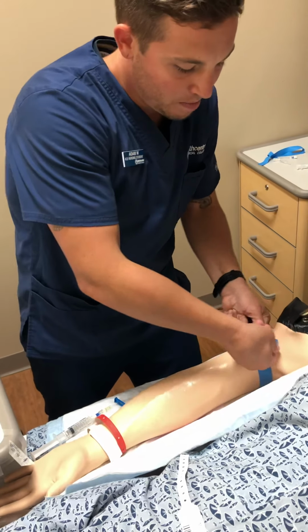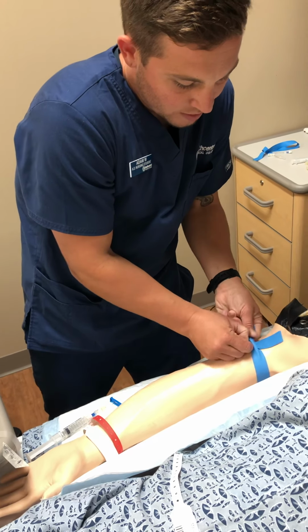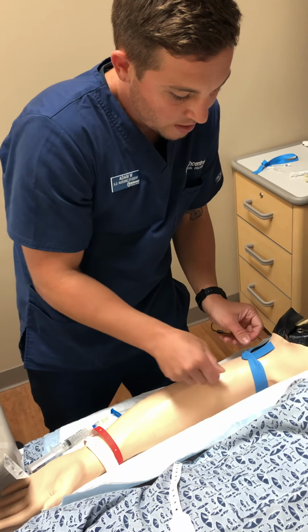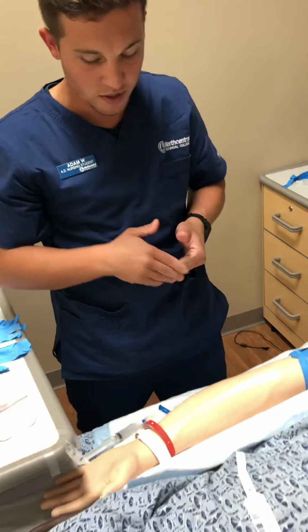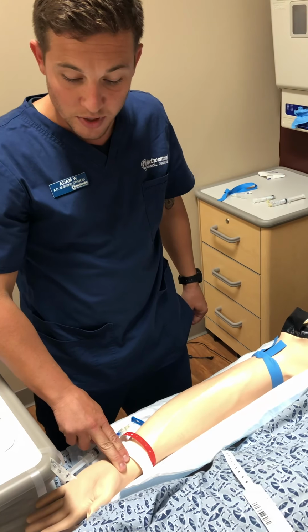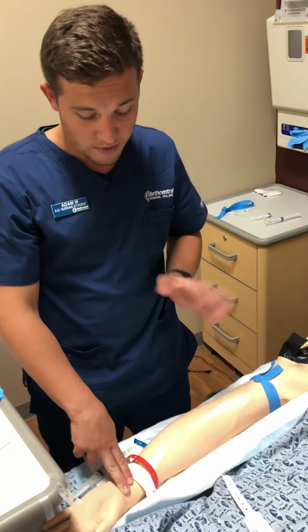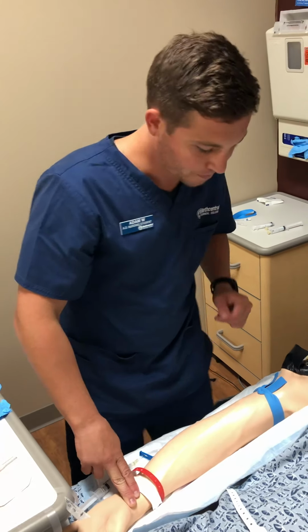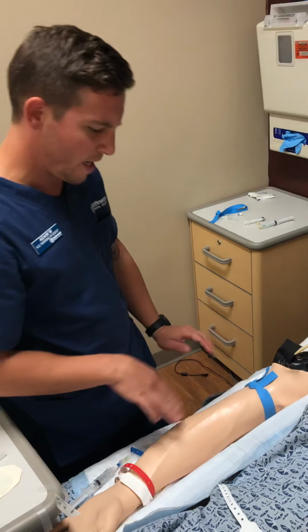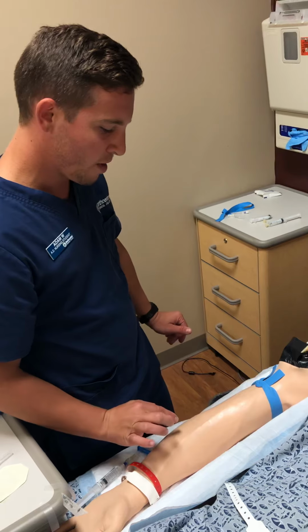So you want it tight, but you need to check. Some things we'll check here to make sure it's not too tight. First off, Mary, how does that feel? Okay, it feels okay. It says it feels fine. I'm going to check her radial pulse. I see that we have a radial pulse. This is good. We do not want to occlude the arterial veins here, the blood flow, okay? So you can assess the site, find the best area, the best site here, the best vein. So I see we have a nice straight vein here.